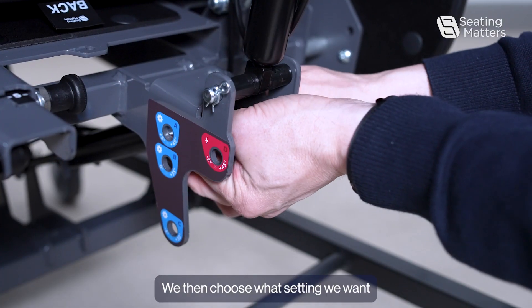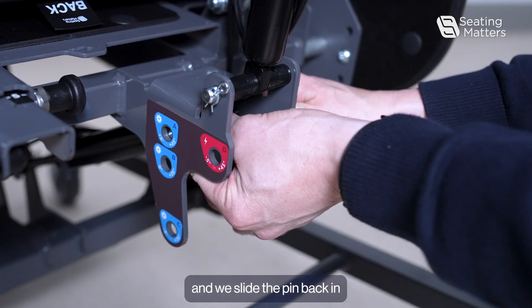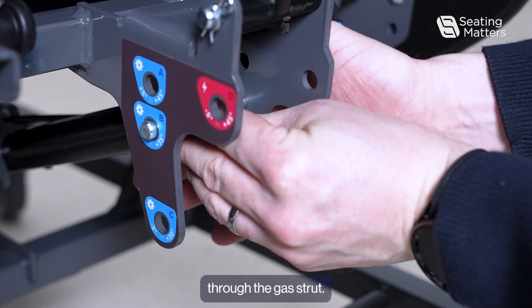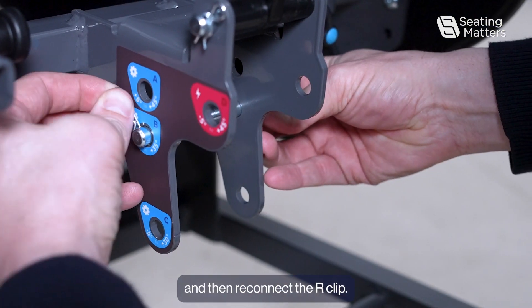We then choose what setting we want and slide the pin back in through the gas strut, and then reconnect the R-clip.